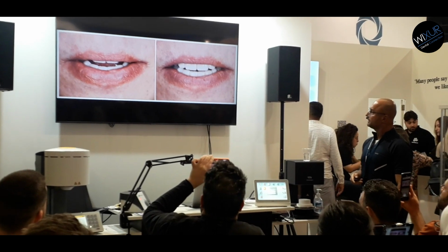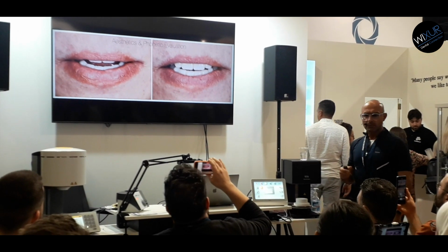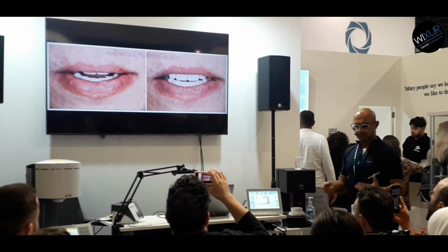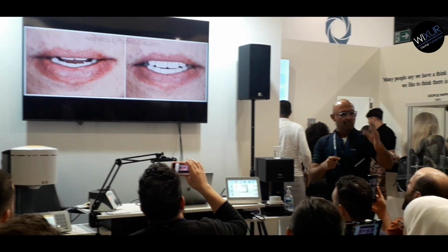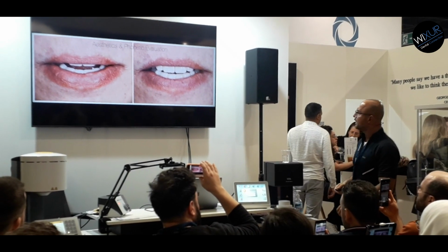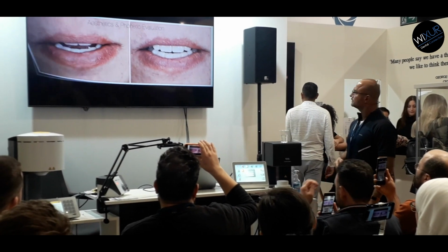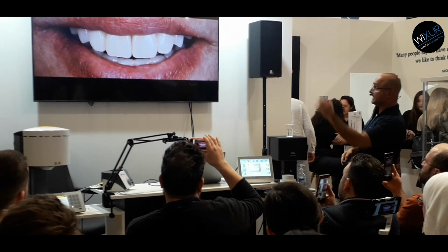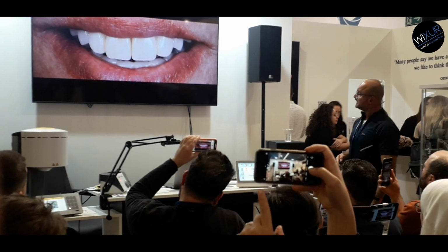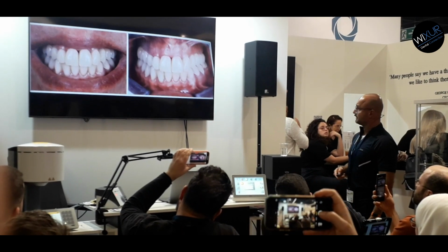And when they went in the mouth, she said for the first time, it's strange, but now I can feel my mouth. I can feel that I have every contact. We asked her, is it comfortable? She said yes. She needed to grind a little bit here and there to create the comfort in the mouth. And she said, I feel good. So we can now check the aesthetics and also evaluate the function in the mouth.